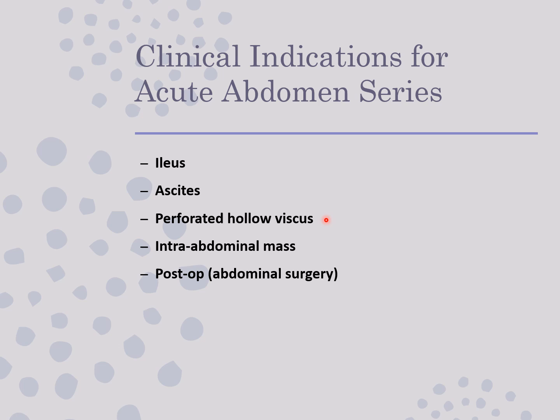Now, anytime that they order abdomen and there's one view that would be considered erect, that should be done first. All of our erect images should be done first because it's most likely the case that the patient, if they're ambulatory, they've probably been sitting somewhere, whether it's on a stretcher or in a chair, maybe in the waiting room. They've probably accomplished the 5 minutes of upright that's needed for these images.